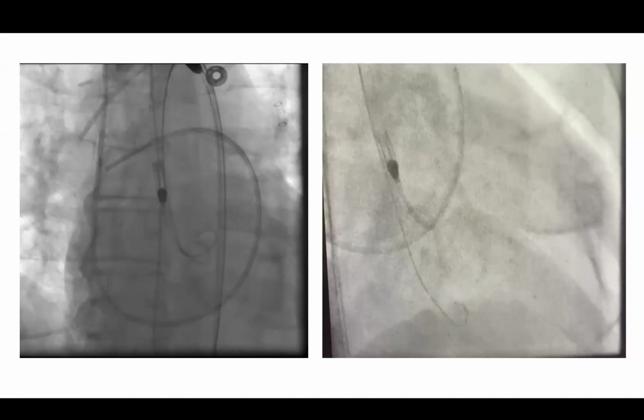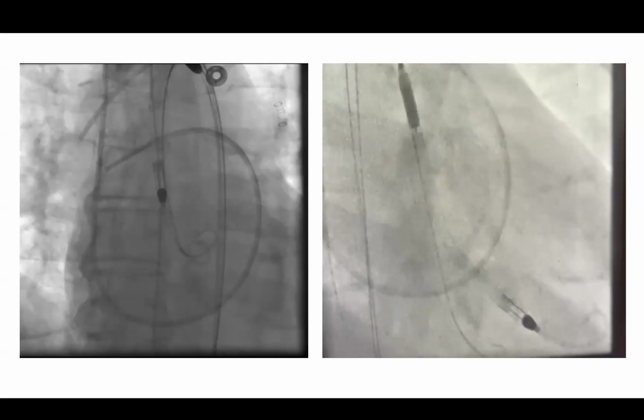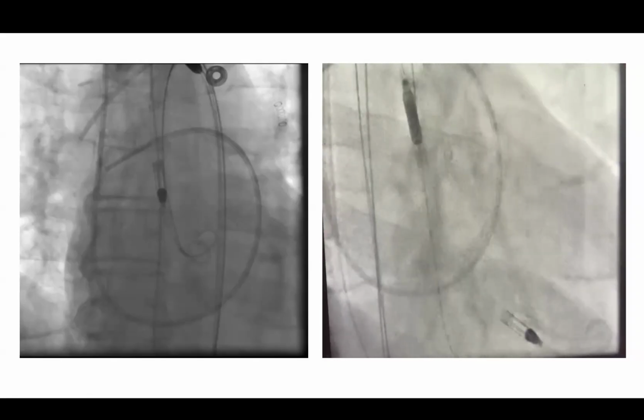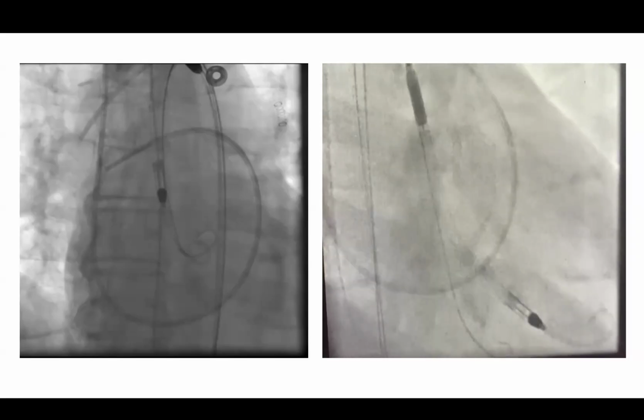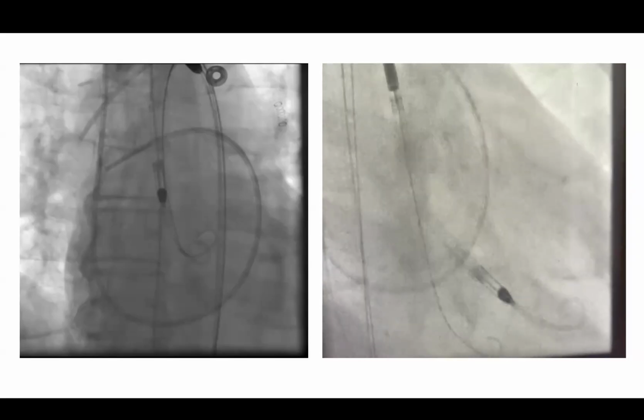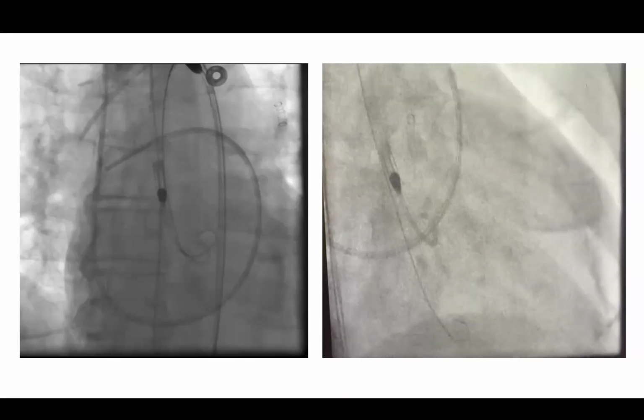So that was a nice trick. And then we had someone give compliments, saying that snaring, you're not home free just because you got that wire across the valve. Definitely. But it did make a difference, I want to think, because we couldn't get it just by pushing and pushing, and this was the first try with the wire across.